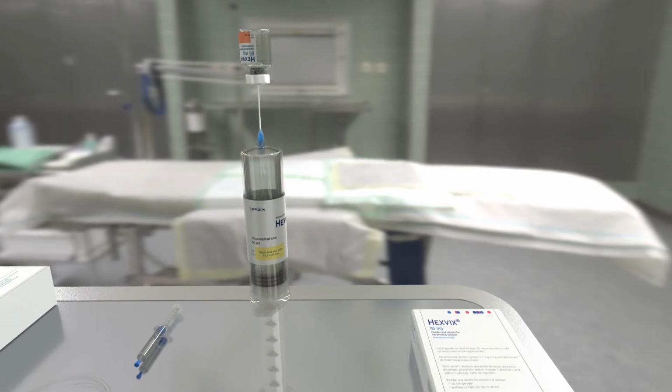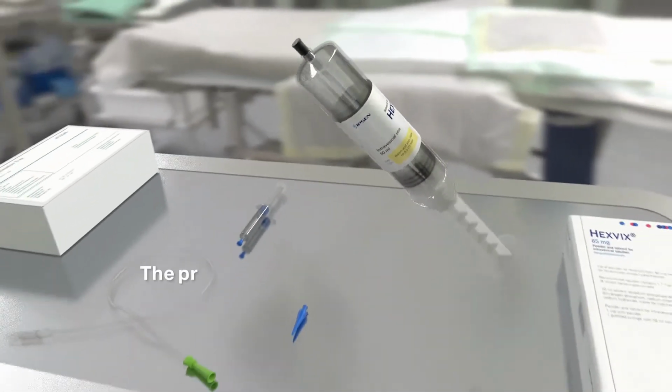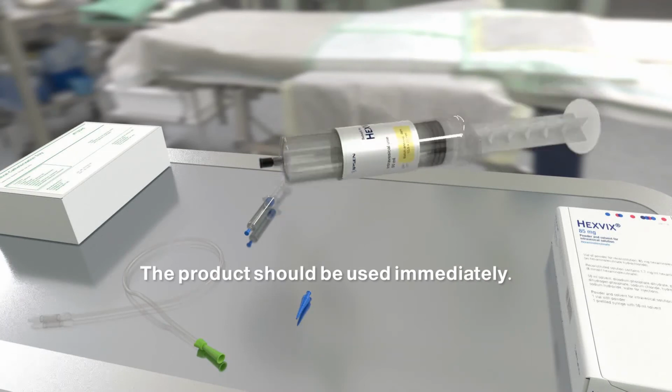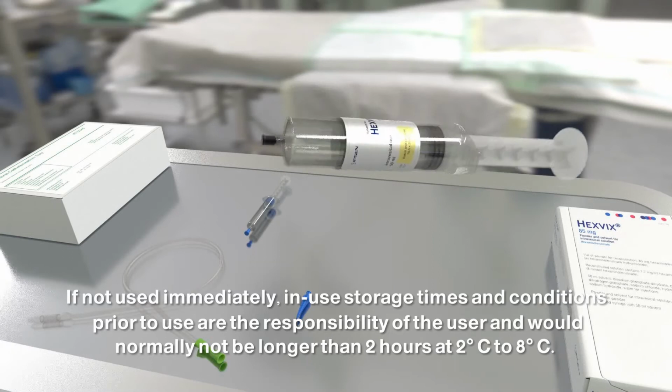Disconnect the empty vial from the syringe. Disconnect the needle from the syringe tip and discard it. Plug the syringe with the syringe cap. Gently mix the contents of the syringe. Hexvix is now reconstituted and ready for use.